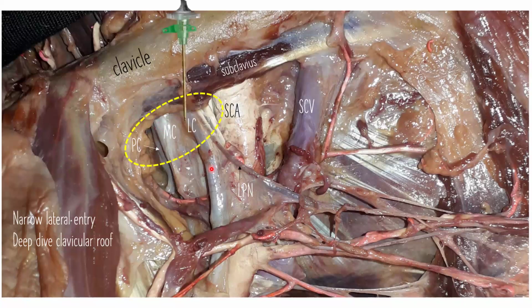While with the out of plane technique in this case, many times it becomes easier to insert the needle just through the subclavius and the pectoralis major, and just point your needle in between the lateral cord and the medial cord, and you inject a local anesthetic. The big challenge again here is to identify the needle tip, as is a problem with the out of plane techniques, and you need to be very cautious to identify the needle tip.